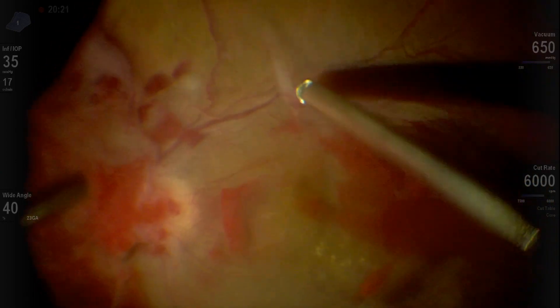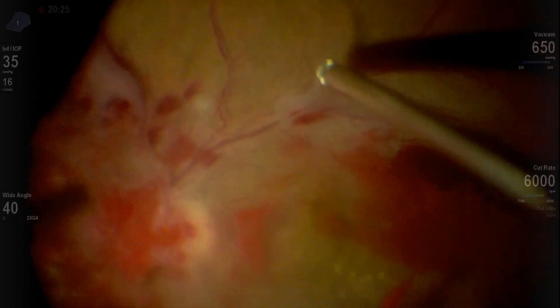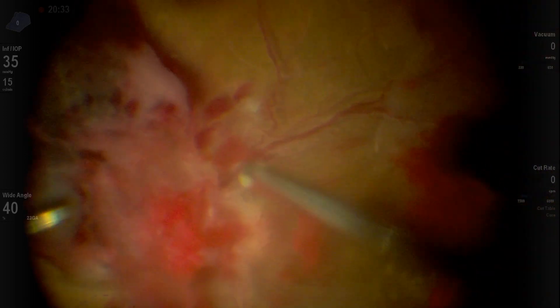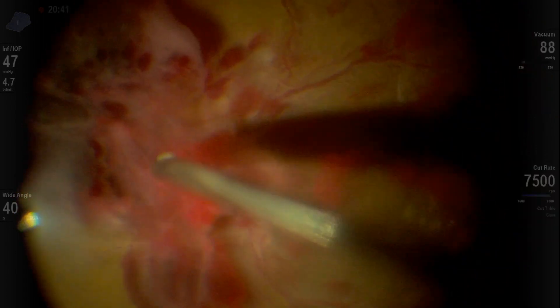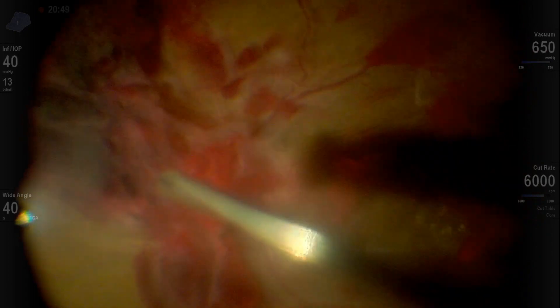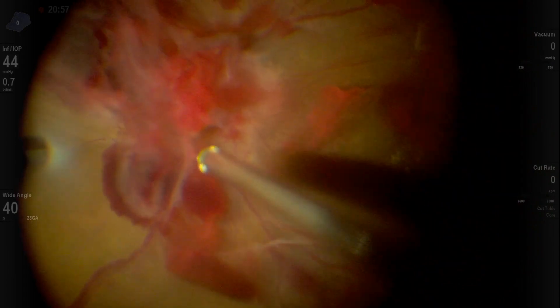The 23 gauge cutter is fantastic for cutback delamination because it has a larger sphere of influence. Once the membranes are a little bit on the loose side, they flow better to the 23 gauge cutter. The 27 gauge cutter is nicer to get under the membranes, so it's just good to understand the difference between the two.